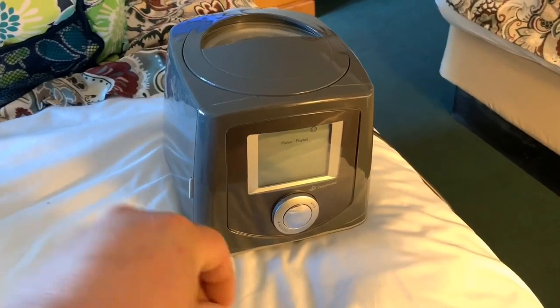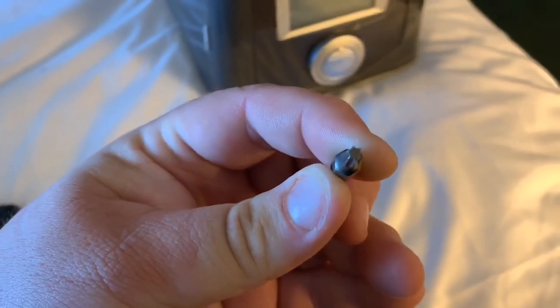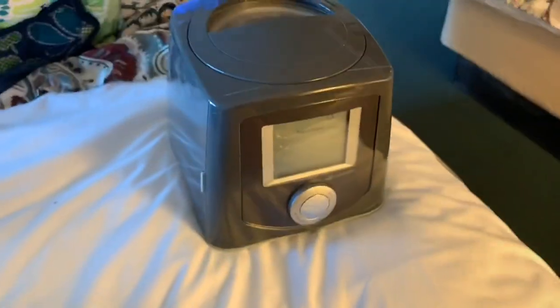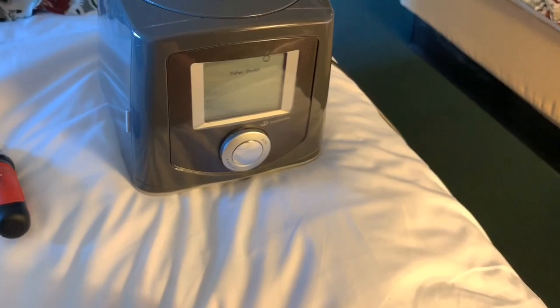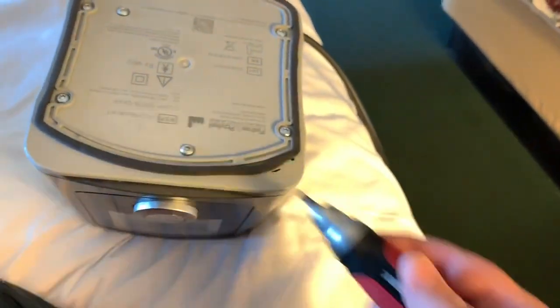The first thing you would need is a Torx T20 star bit — that's a T20 bit. Because I've had this happen before, I brought just a little ratcheting tool to get the screws out to take this apart. You want to be careful when taking it apart with electronics. Once you have your tool, the T20 Torx bit, you want to flip this thing over.